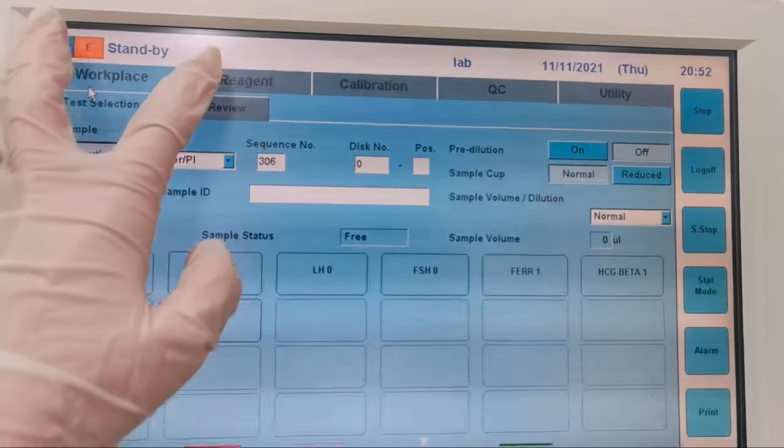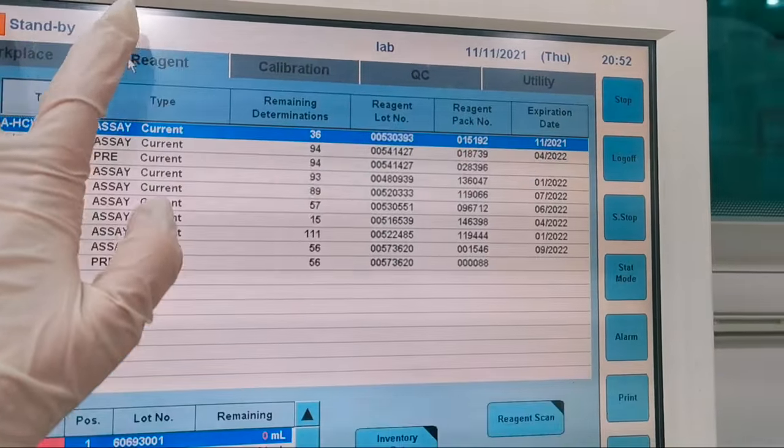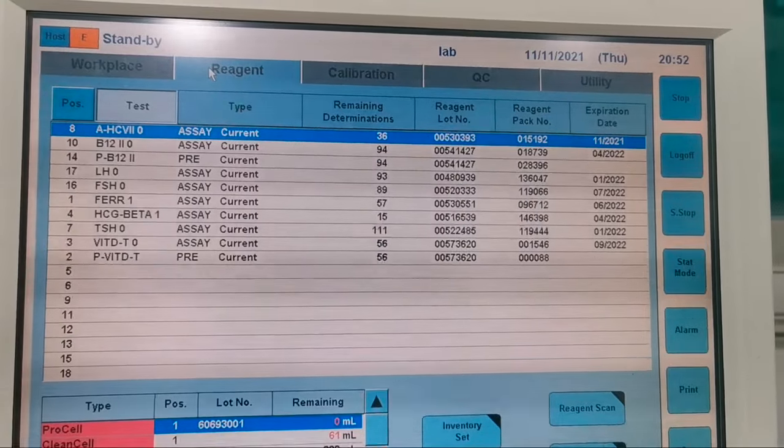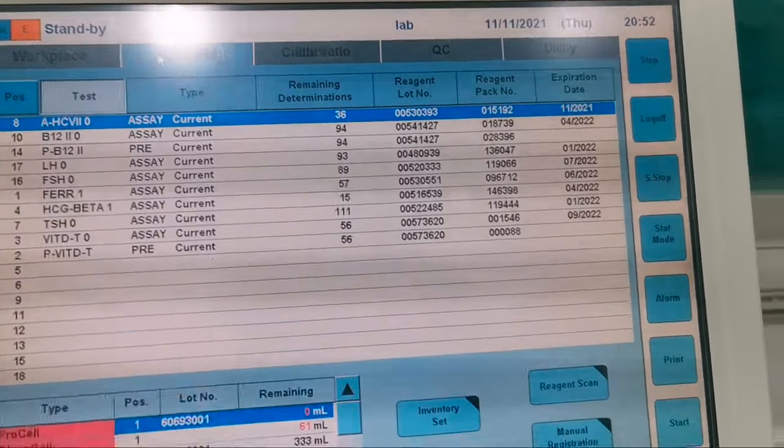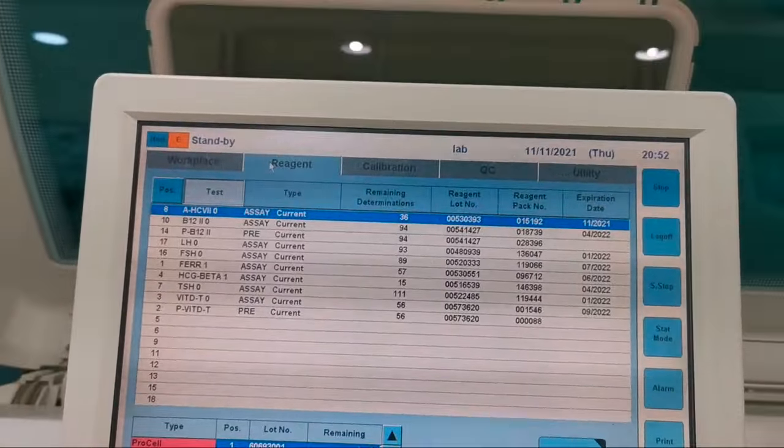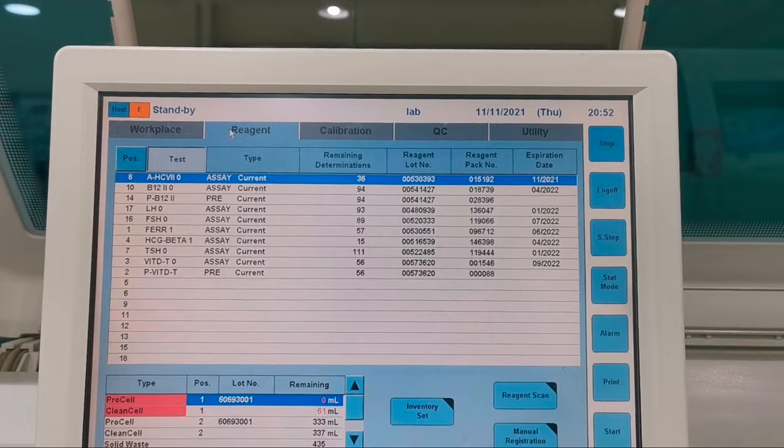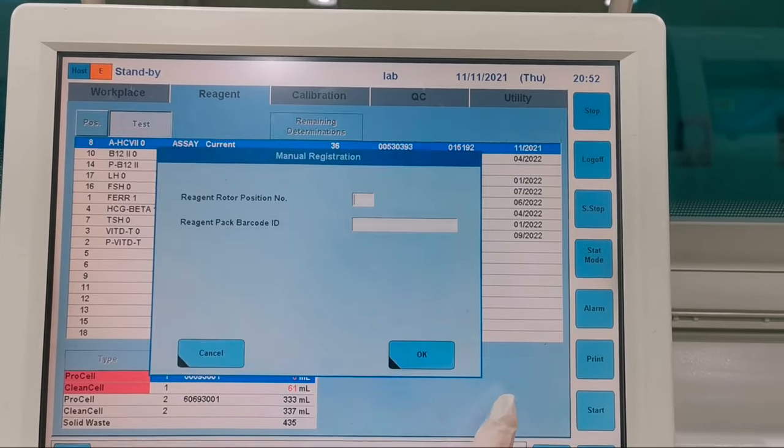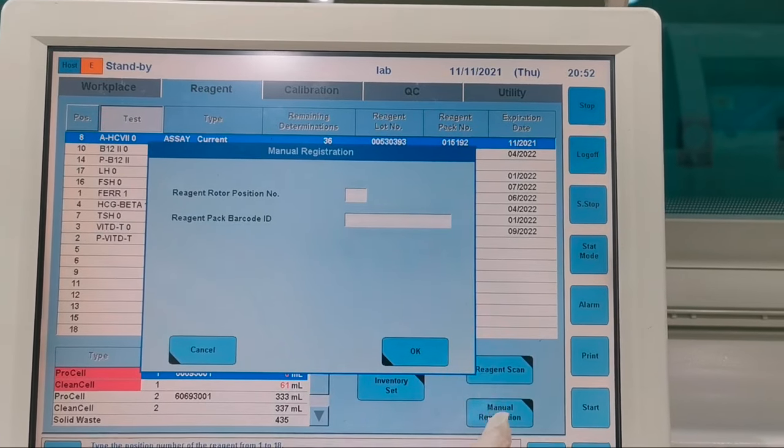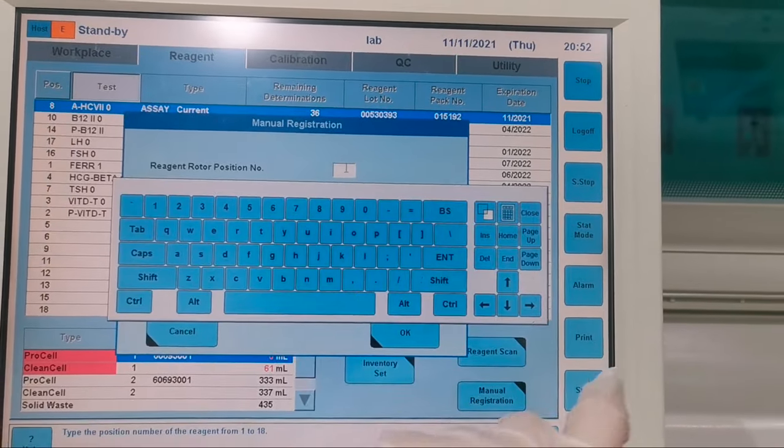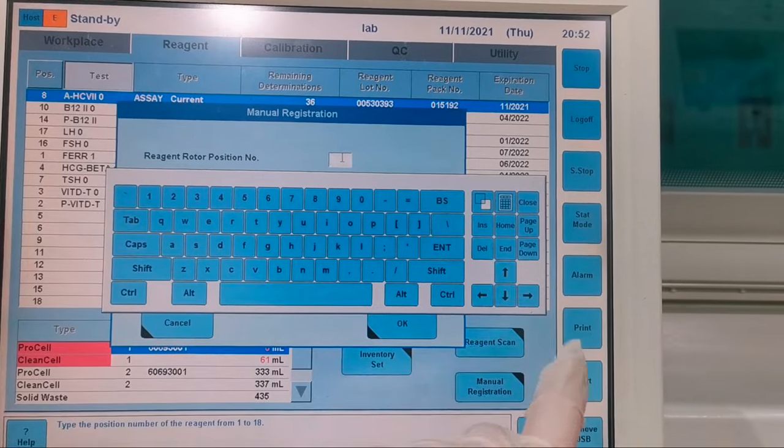Go to Reagent, then search for Manual Registration. Select Manual Registration. We will see Rotor Position Number and Reagent Pack Barcode ID.